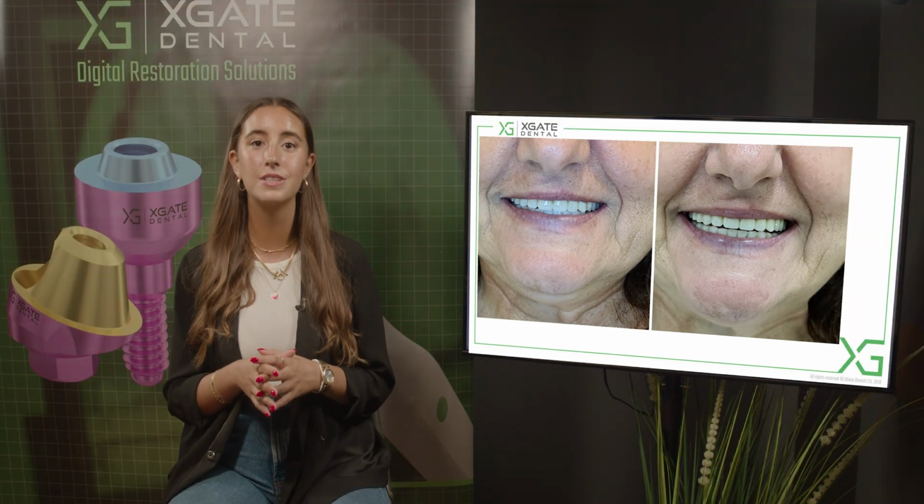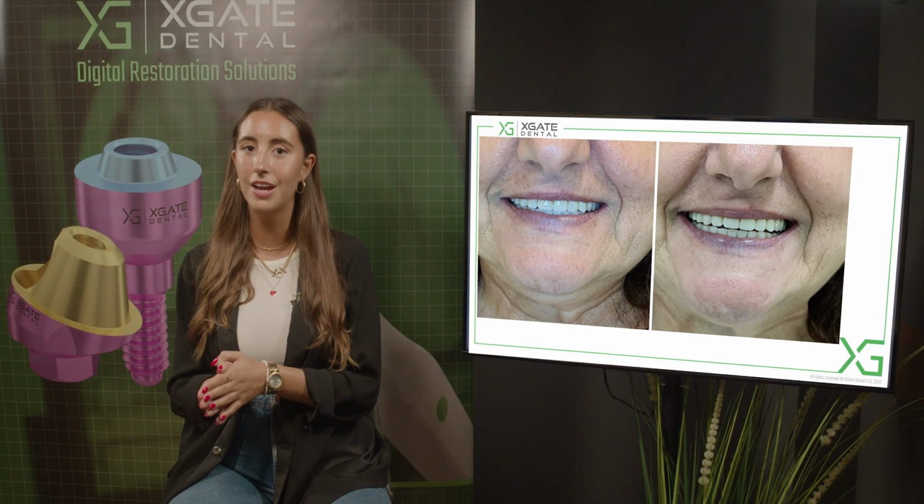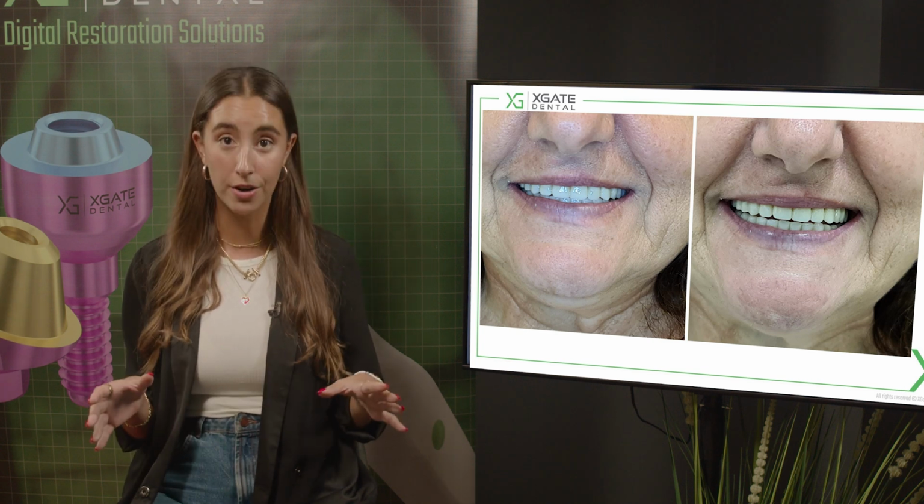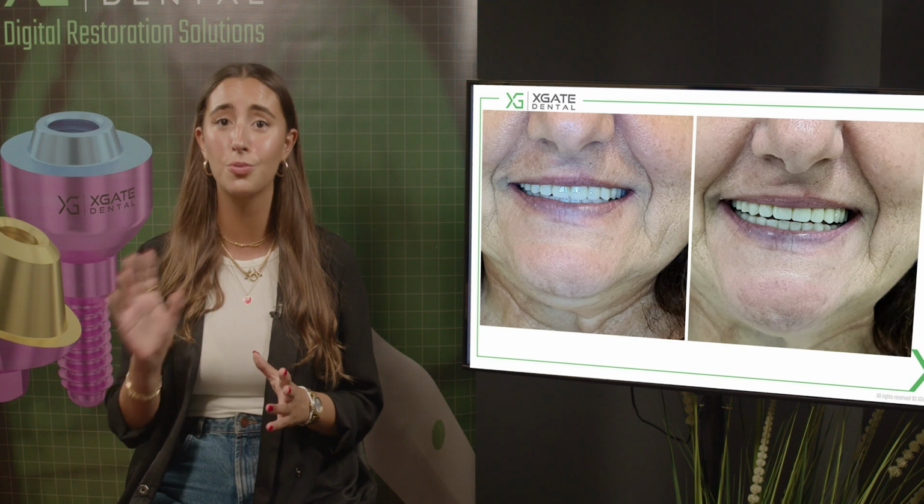You can see the plastic pins that we closed the zirconia bridge with, and her final smile with different types of lighting. So in this, you can see that the bridge is a little bit whiter, and here a little bit yellower. But all in all, you can see that all over it is the same level. It's much better than what she had before. The midline is great, and the smile looks fantastic.